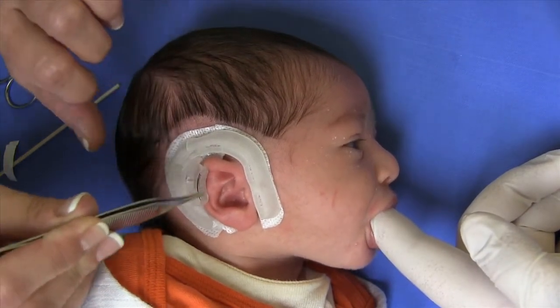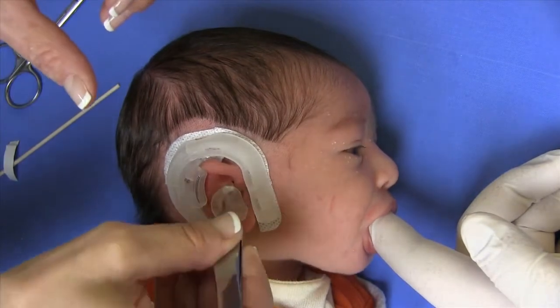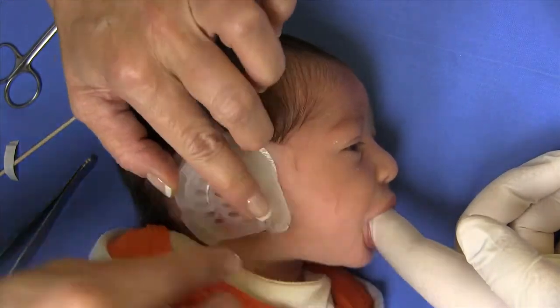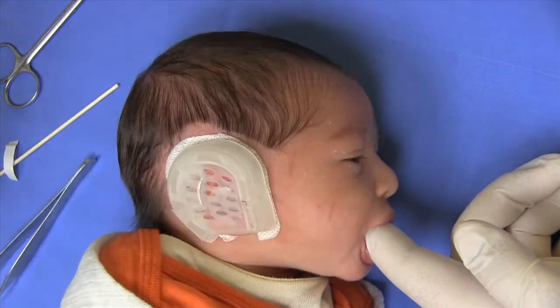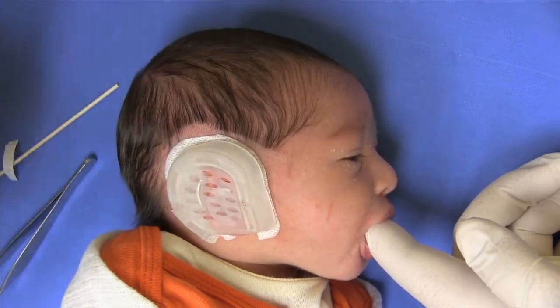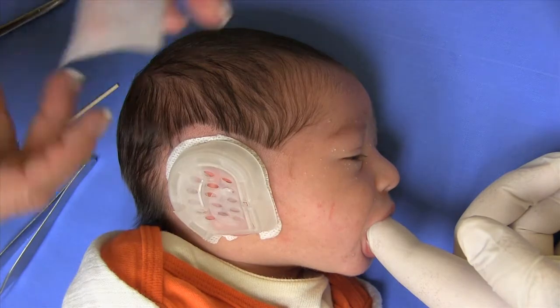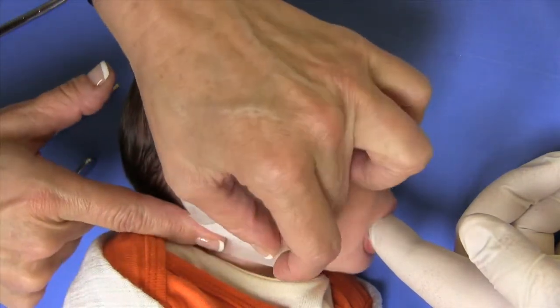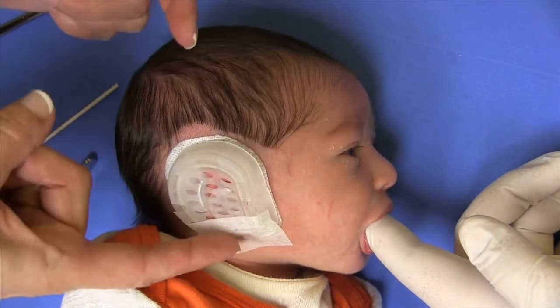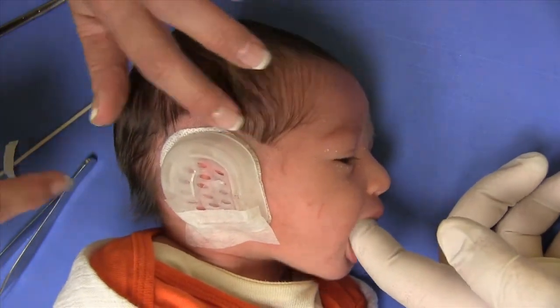You can see we've got a nice curvature there. And then I'm going to place the former inside. I'm going to take just a piece of the micropore — you can also find smaller rolls of these in your kit — and we'll place that right over the base here. This is also helpful to use the tape like this to keep the little ones from getting their fingers up underneath there and pulling that cradle off, if you have a very active child.